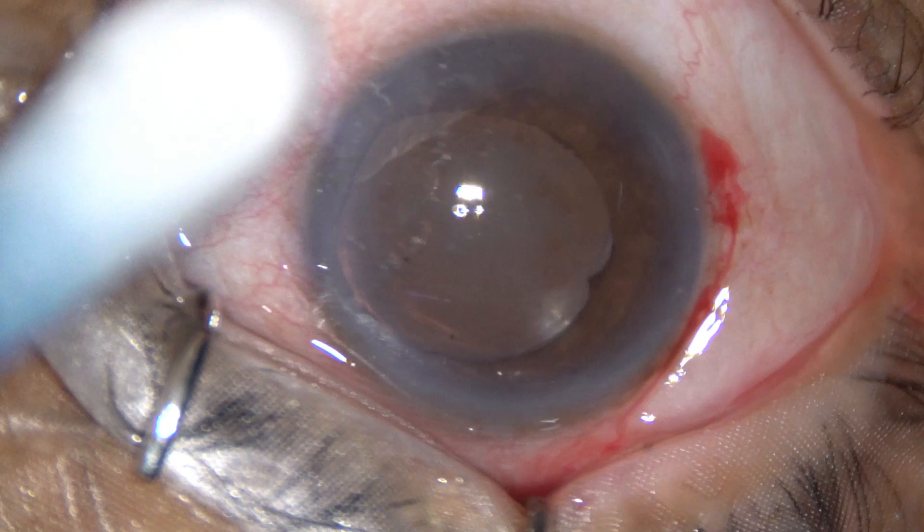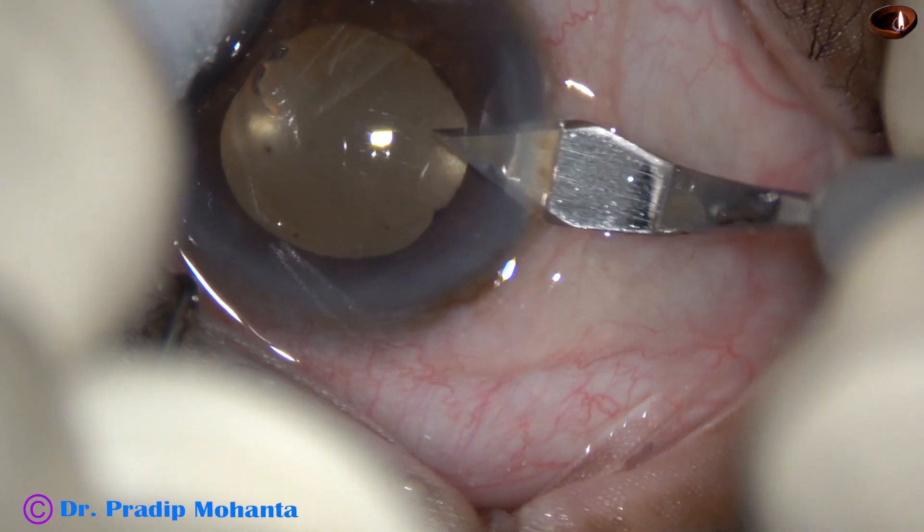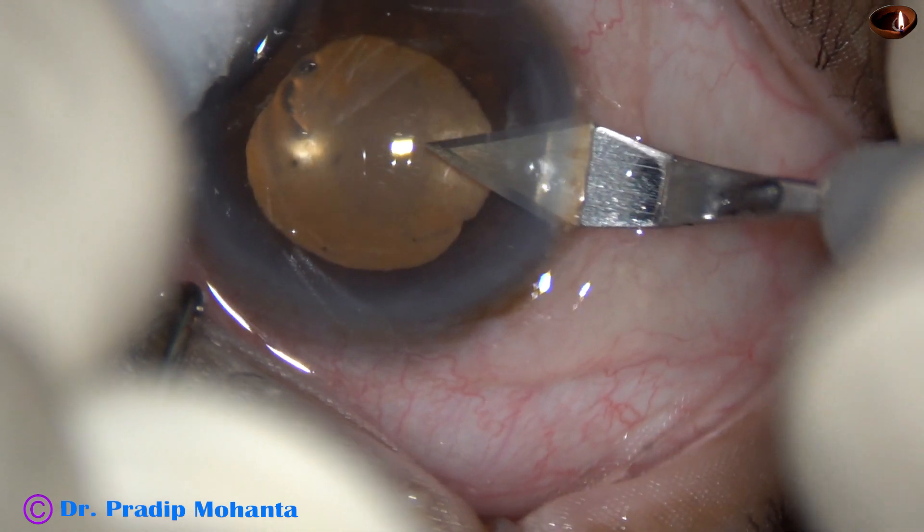This patient was operated elsewhere and has developed a thick fibrinous inflammatory membrane around the intraocular lens. What should we do in such cases?